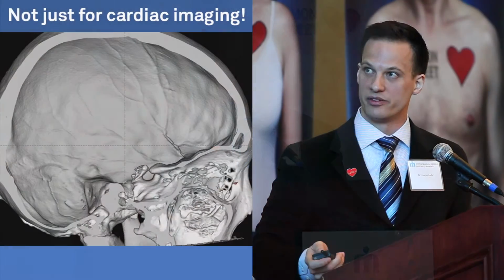To give you an example, this is a patient who was found to have an abnormal tangle of blood vessels in the brain. It's a similar picture to what Dr. Olivier showed. Because of how fast it is, we can basically capture a movie of these blood vessels coming into the brain and help the clinicians map out how they're going to treat it. And this is what the video would look like.